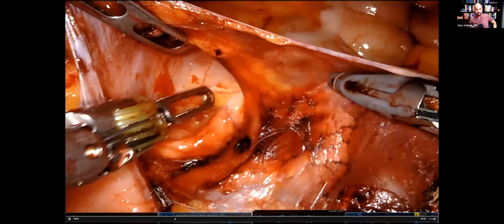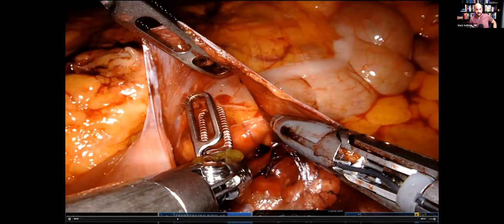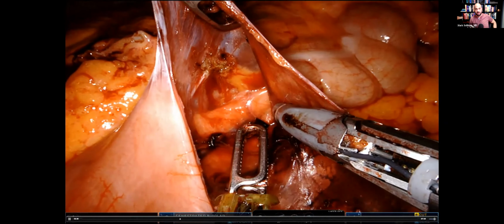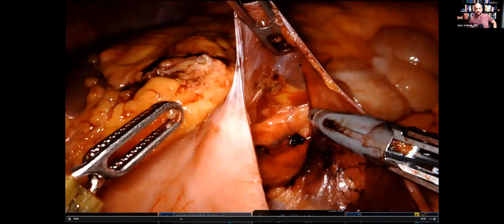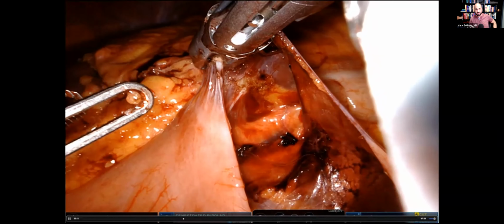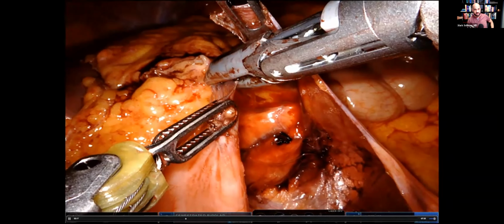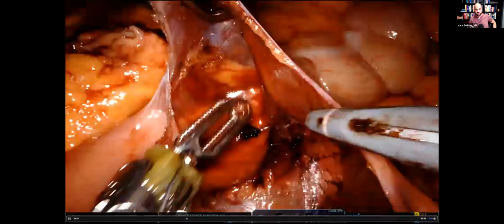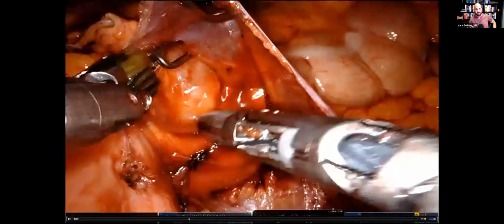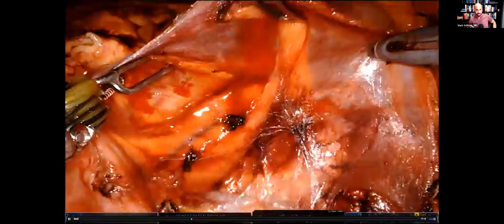Pushing the pancreas down. And as I'm pushing the pancreas down, I'm always keeping my mind's eye on the lesser sac. So I'm trying not to head directly towards the spleen. I'm trying to head basically to the transverse colon, transverse mesocolon, so I can try to find, again, a lesser sac. So that's the next move here. I know this discussion isn't about splenic flexure mobilization, but this dissection comes so hand in glove with the splenic flexure mobilization. I just want to play it out, since the video is already here.